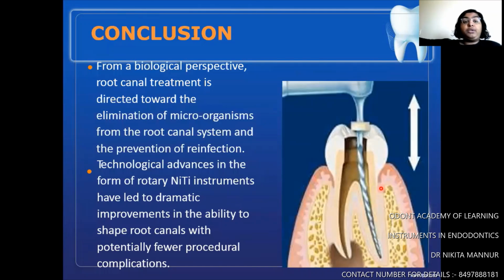Coming to the conclusion, from a biological perspective, root canal treatment is directed towards the elimination of microorganisms from the root canal system and the prevention of reinfection. So now the technological advances that we have in the form of rotary NiTi instruments have led to dramatic improvements in the ability to shape the root canals with potentially fewer complications.